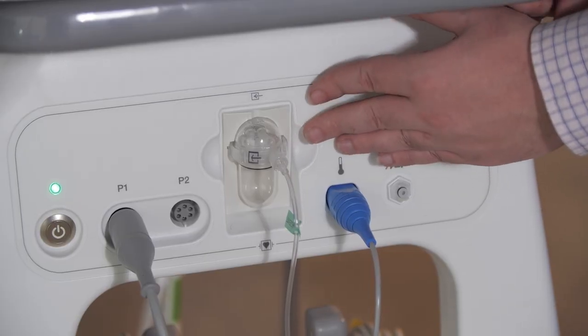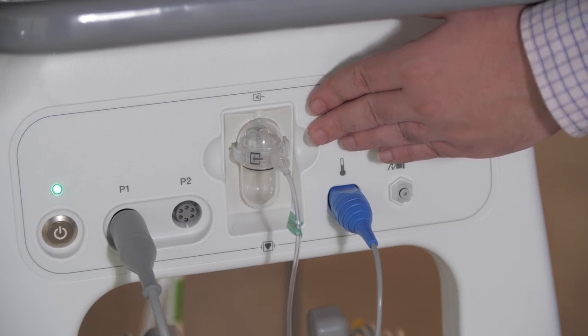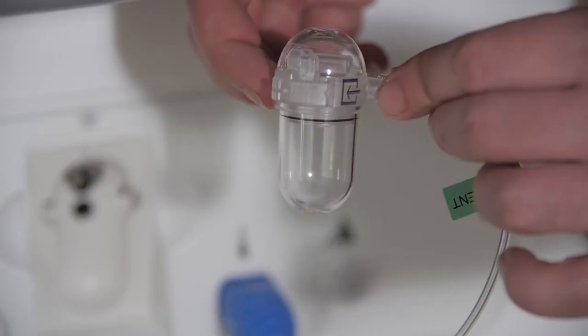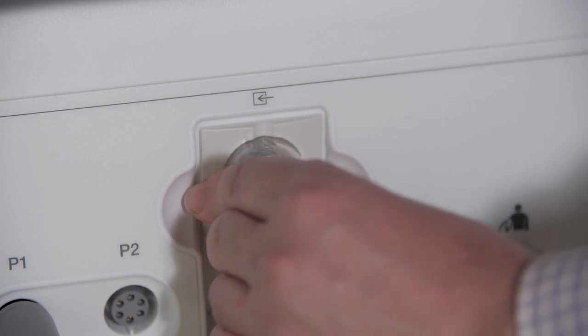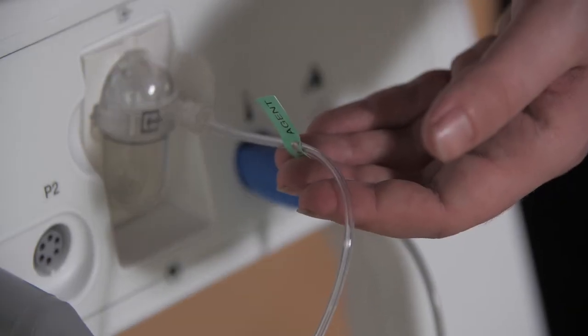Always check the water trap in the middle of the MR400's console before attaching the device to your patient. Also check the filter atop the water trap to make sure that it's still white. If the filter is not white, or the water is up to the black line on the water trap, swap the water trap out. Sample lines to the water trap are for single use only. Only connect a sample line straight to an elbow tube or a nasal cannula. The monitor is calibrated specifically for a sample line of this length and diameter. A different sample line, or several sample lines connected together, will negatively affect your reading.